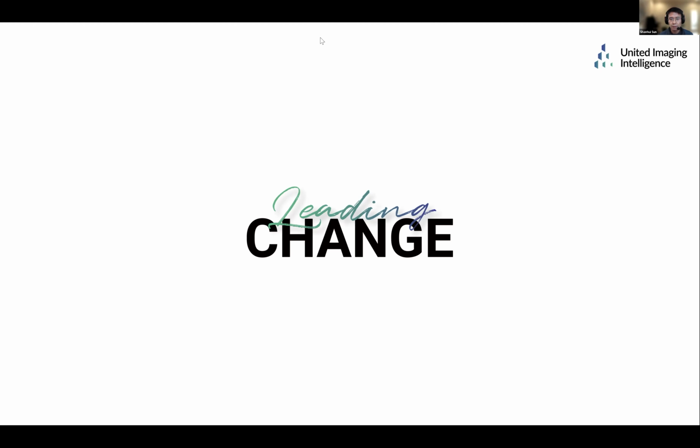Okay. We have one last question. How do we know that the result of stent enhancement is right? Basically, the stent enhancement result is not synthesized based on deep learning. We just overlay all the images together. It's just an image processing problem.